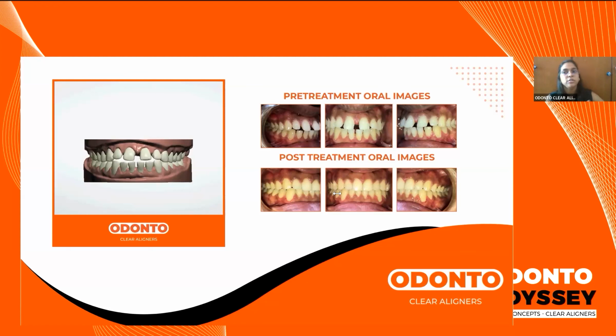After that, again, you need to use the gauge to ensure that you have done the optimal amount of reduction. So yes, it is always better to polish after proximal stripping, in those sharp line angles, because teeth naturally don't have very sharp lines at the edges at the proximal. They're always rounded.